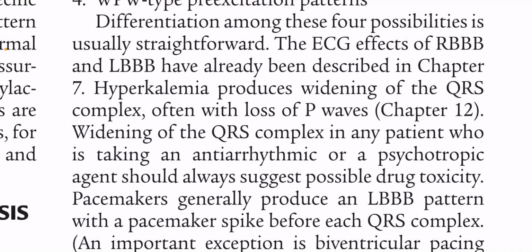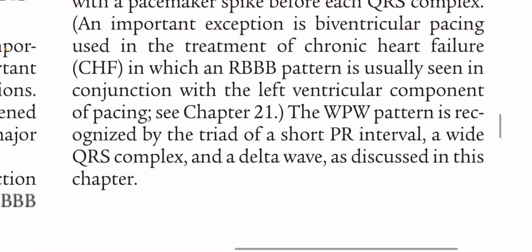The ECG effects of RBBB and LBBB have already been described. Hyperkalemia produces widening of the QRS complex, often with loss of P waves. Widening of the QRS complex in any patient who is taking an antiarrhythmic or a psychotropic agent should always suggest possible drug toxicity. Pacemakers generally produce an LBBB pattern with a pacemaker spike before each QRS complex. An important exception is biventricular pacing, used in the treatment of chronic heart failure, in which an RBBB pattern is usually seen in conjunction with the left ventricular component of pacing.